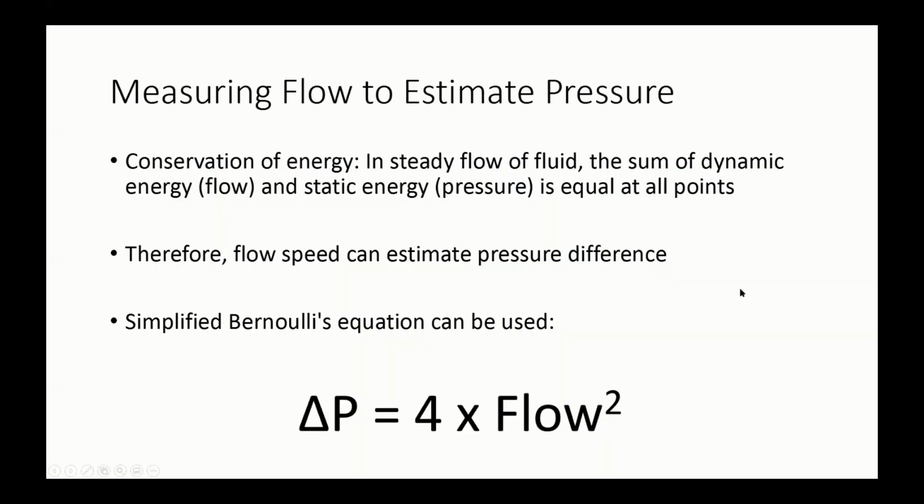Okay, so in fluid dynamics, the conservation of energy is the basis for Bernoulli's equation, Bernoulli's principle. So in a continuum, an area of low flow will have high pressure compared to an area of high flow, which has low pressure. So dynamic and static energy have to be constant in total. So measuring the flow difference can give us information about pressure difference.